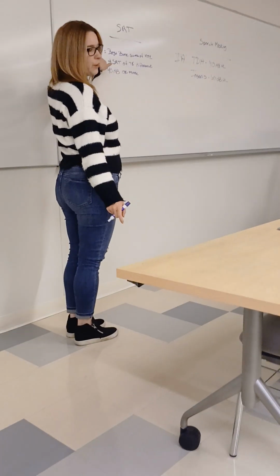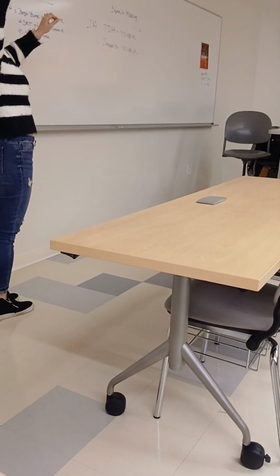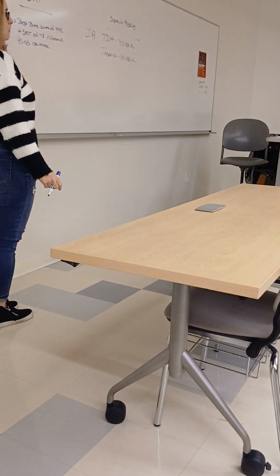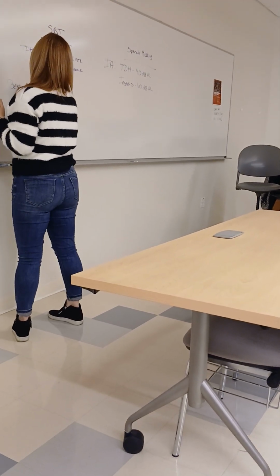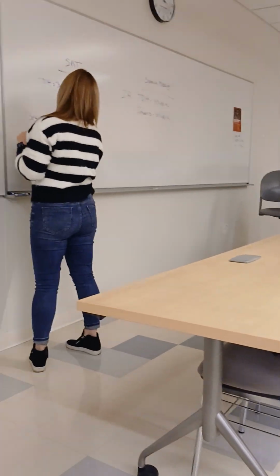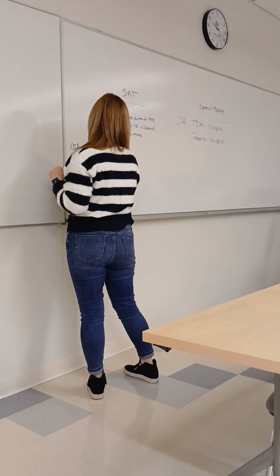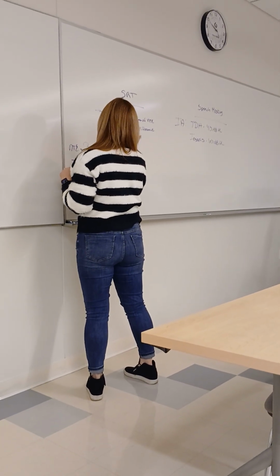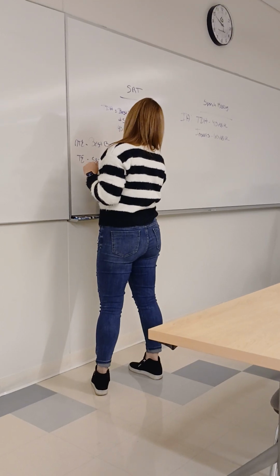Right ear. And the best bone score across all the bone conduction scores on the left side is, let's say, best bone equals 5. And let's say SRT right now equals 45.